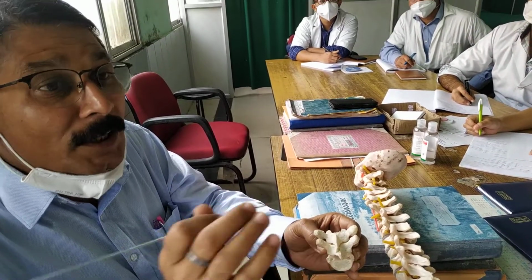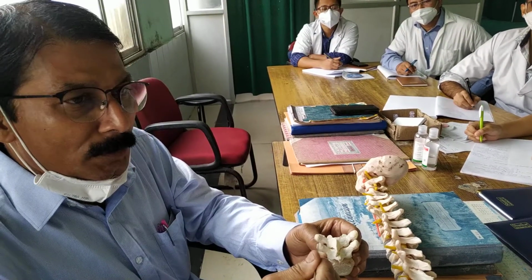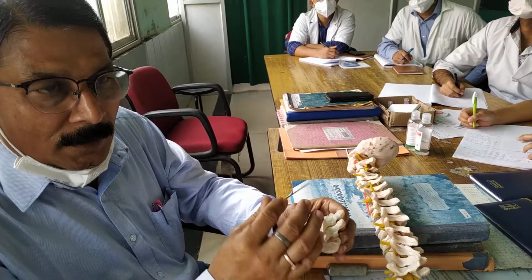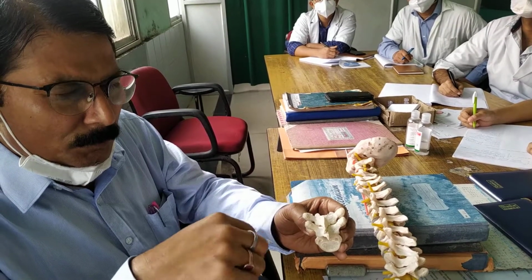You should not feel anything soft there. So soft, you are careful. Bone, you go dissecting like this. So this part is exposed nicely. Avascularity is maintained. You maintain control of your bleeding.